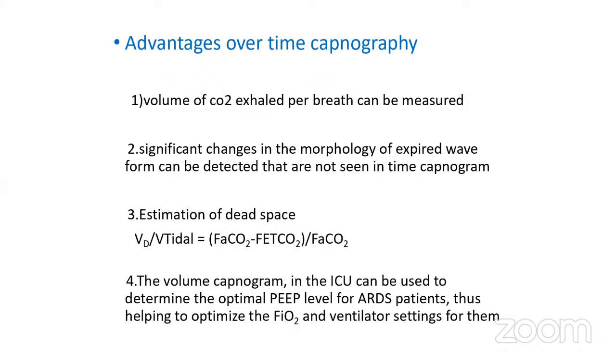Significant changes in the morphology of the expired waveform can be detected that are not seen in the time capnogram. Estimation of the dead space can be done. The volume capnogram in the ICU can be used to determine the optimal PEEP level for ARDS patients, thus helping the optimization of the inspiratory oxygen and also the ventilatory settings.